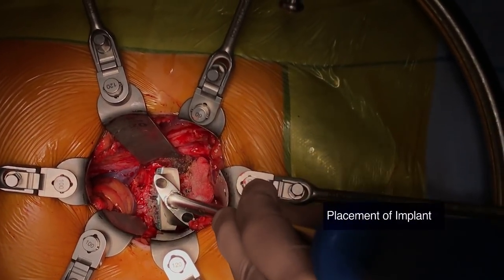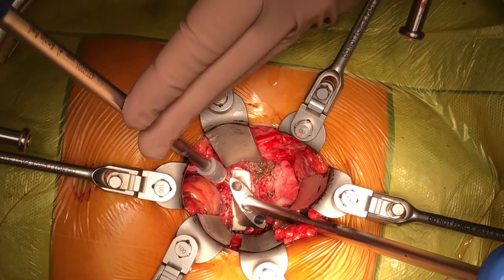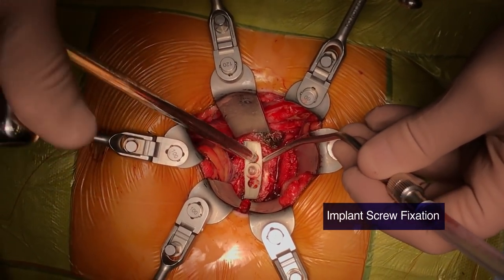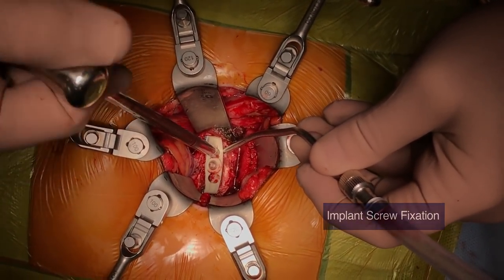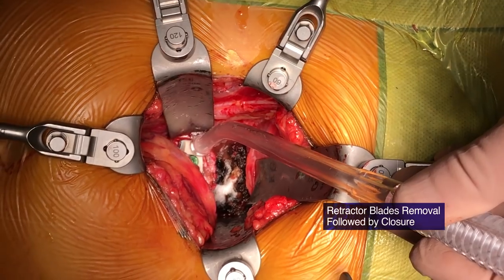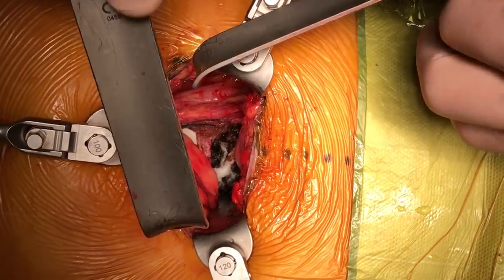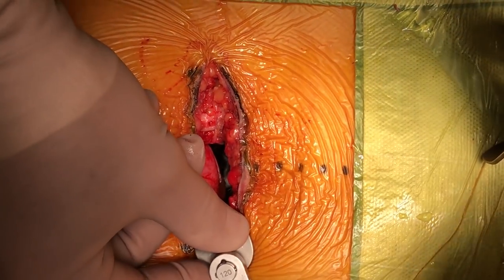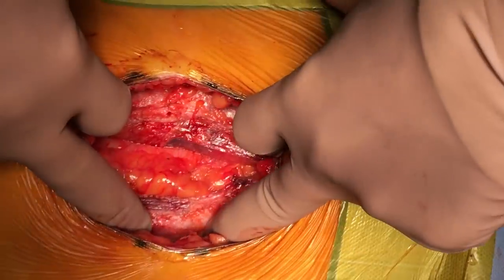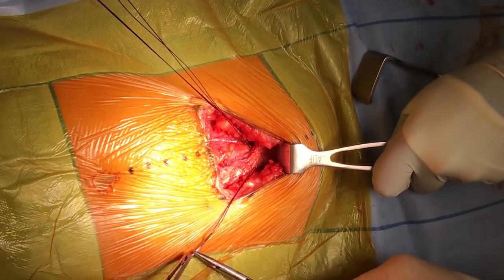The implant is tapped into position as per the trial prosthesis, then final screw fixation is performed. The retractor blades are removed and the peritoneum returns to its position. The midline linea alba is closed with a heavy PDS, then followed by the subcutaneous layers and finally skin.